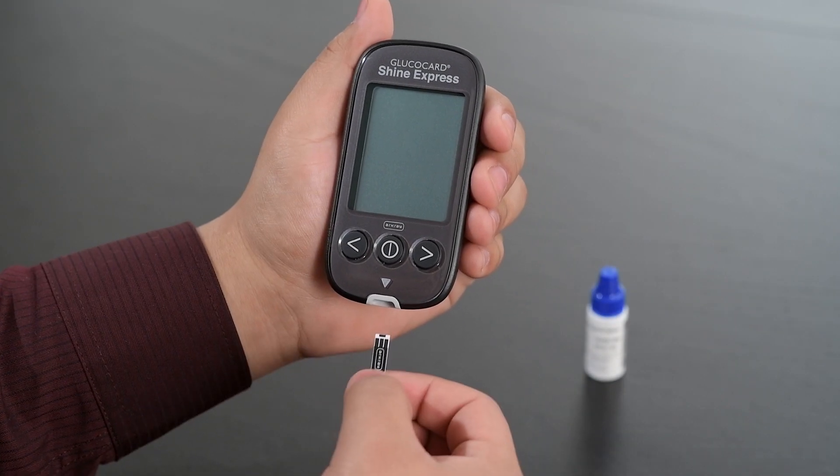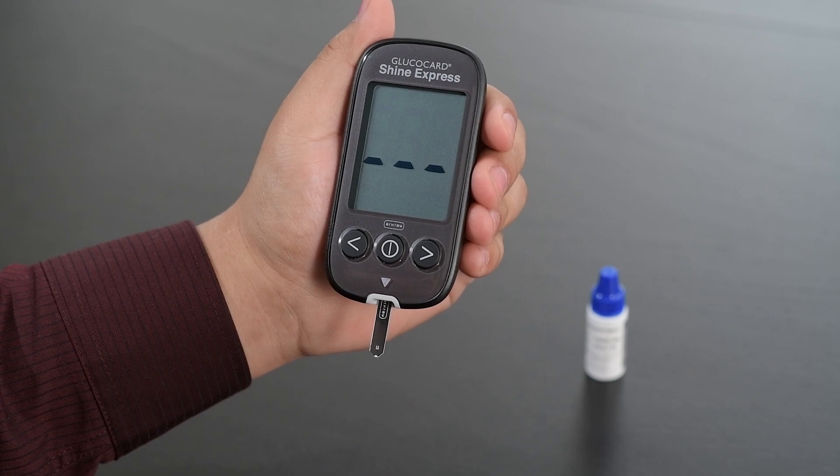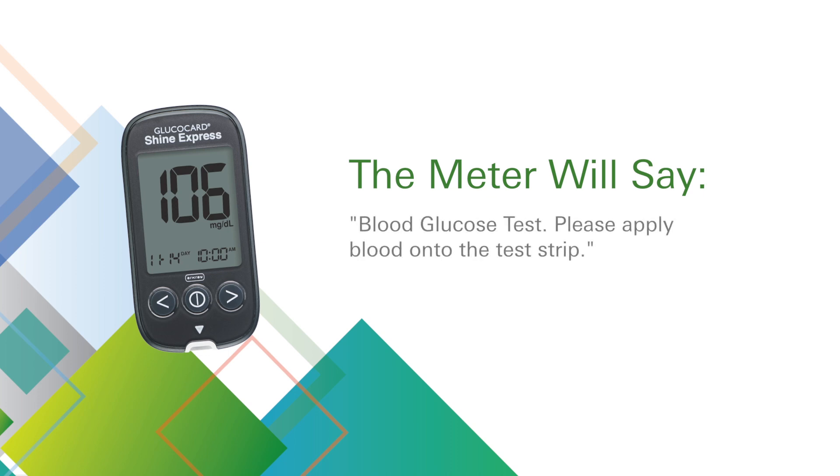Insert a test strip with the insert arrow facing up into the meter. The apply blood sample symbol will appear. The meter will say: blood glucose test, please apply blood onto the test strip.